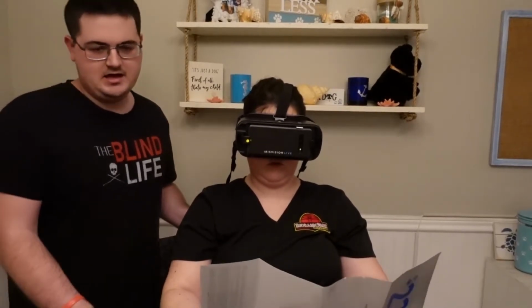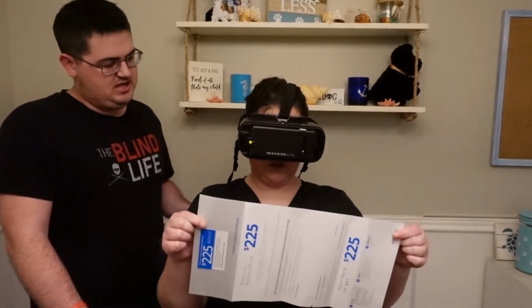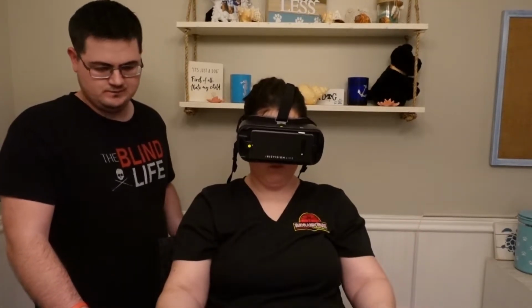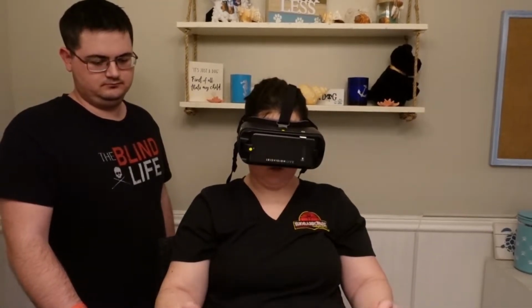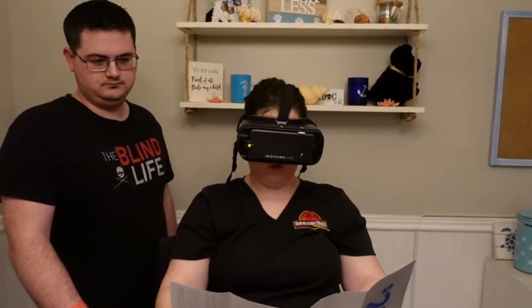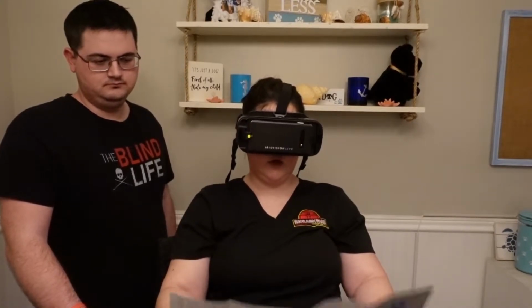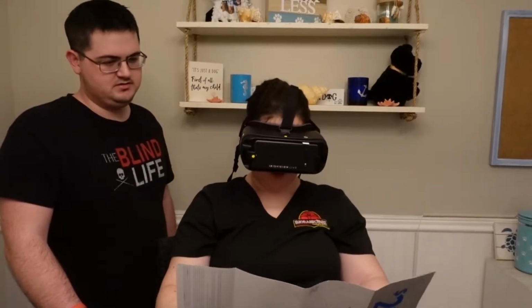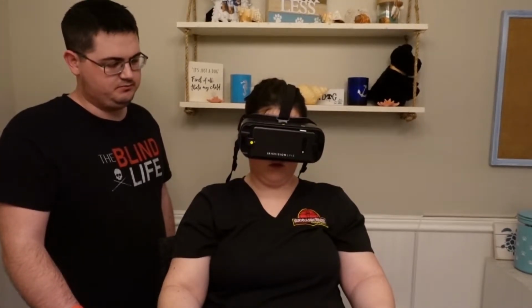So what I mean by that is black on white. The original reading is reading material with black letters on a white background, such as a school book or things like that. For RP patients, you know that that's very hard to do. So instead, let's try the next mode.